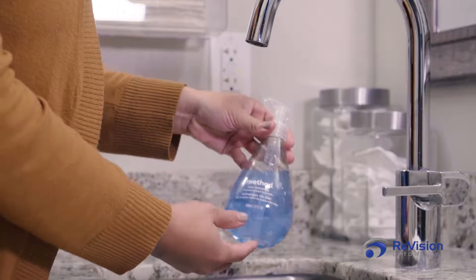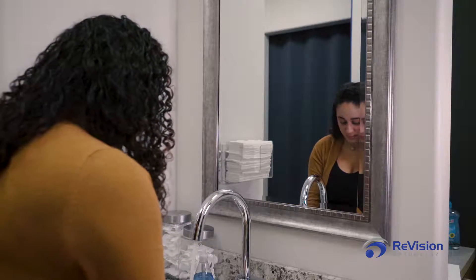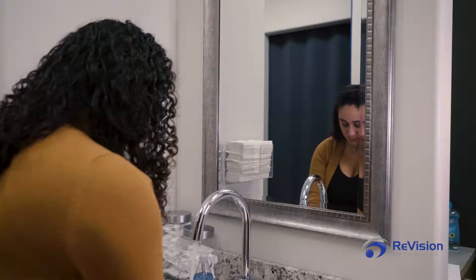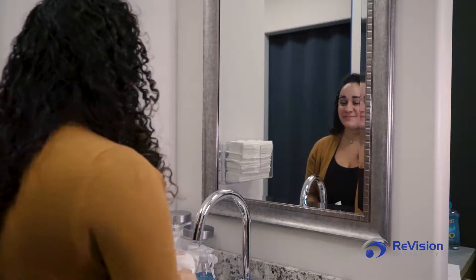It is very important to have proper hand hygiene before allowing any contact with your lenses. Wash your hands thoroughly with a mild soap that does not contain moisturizer or perfume, and dry them completely with a clean, lint-free towel. The additives from a soap with oil, lotion, or perfumes can transfer to the surface of the lens, causing blurring or irritation.